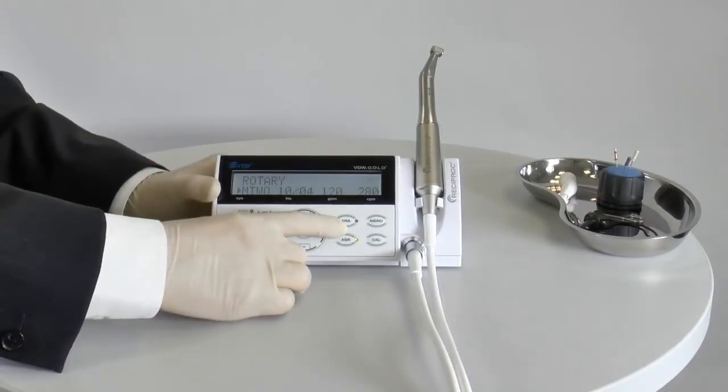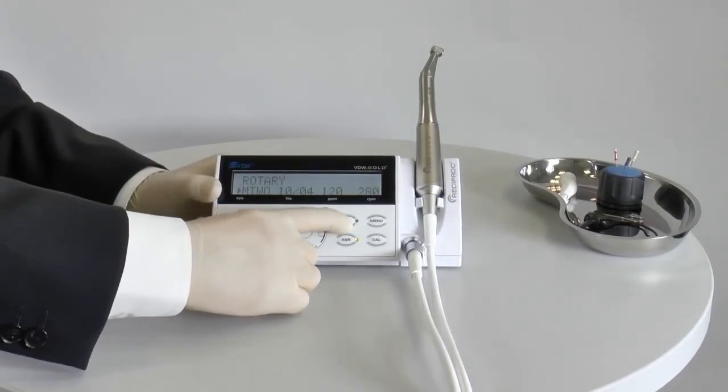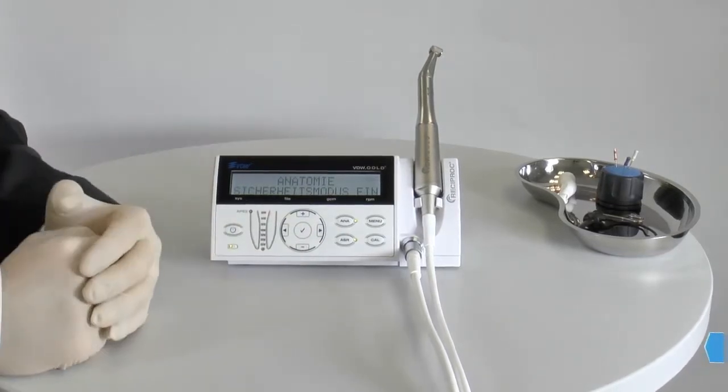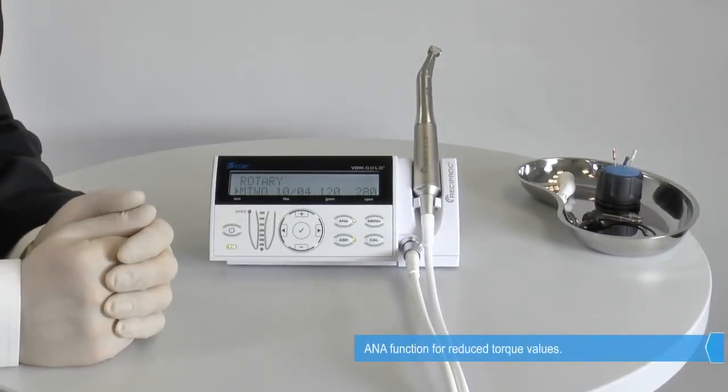The second safety function for rotary file systems is activated by the ANA key. The abbreviation ANA stands for the word anatomy, or rather difficult anatomy.